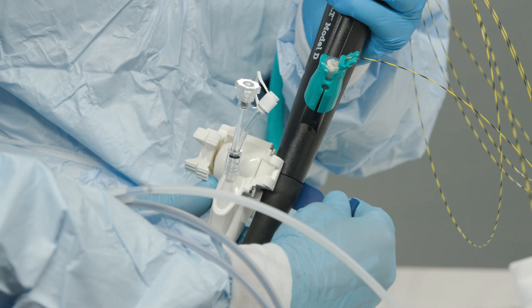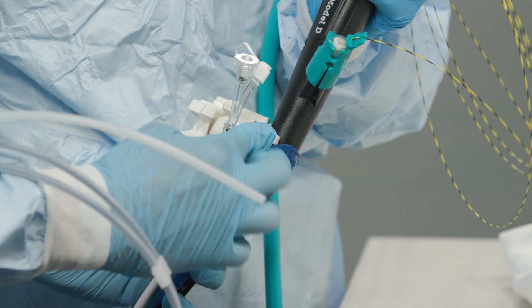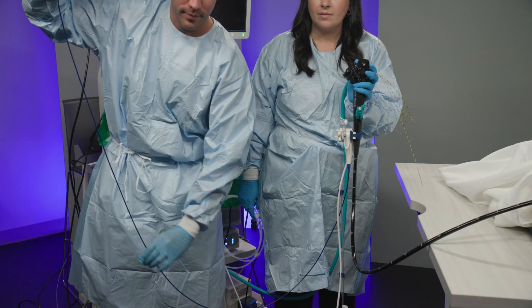Attach the SPI catheter to the scope first. Carefully attach the SPI Scope to the handle of the duodenoscope. Make sure the catheter is in a perfect U shape.